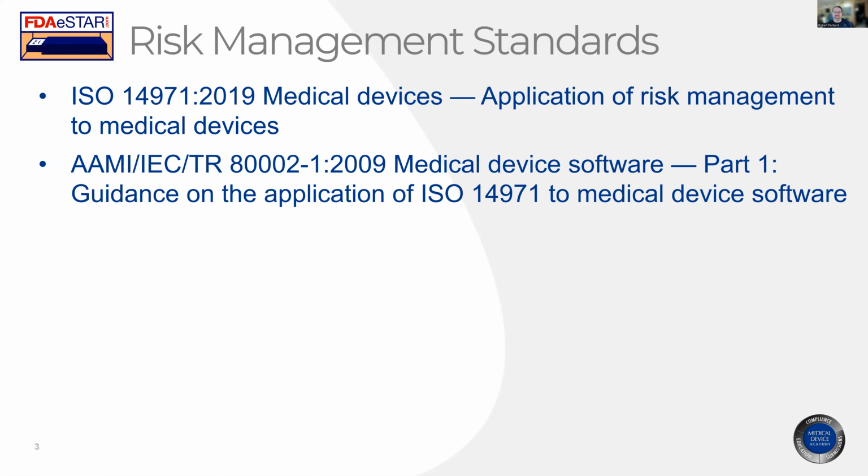So this is a really good example of how to do this, not just for medium risk and low risk devices, but high risk too. This is how I would do it. If you want to do something high quality, you start with the highest risk and do it that way. And if the FDA wants to see less documentation, great, but at least you know you have done a good job of this and you should have fewer problems with your device. So don't just come up with a couple lines here. Go to that standard, buy it, read it.